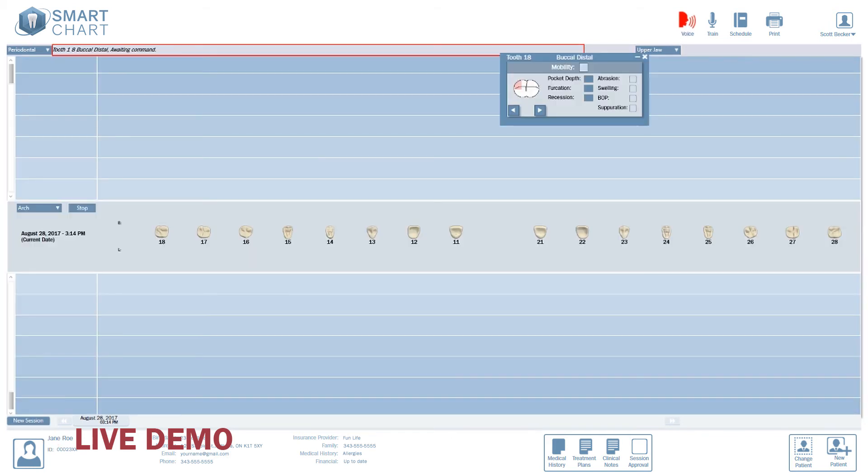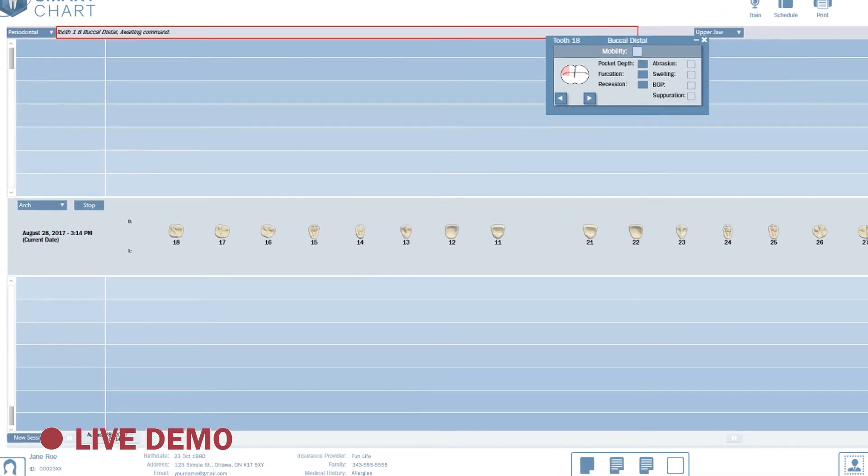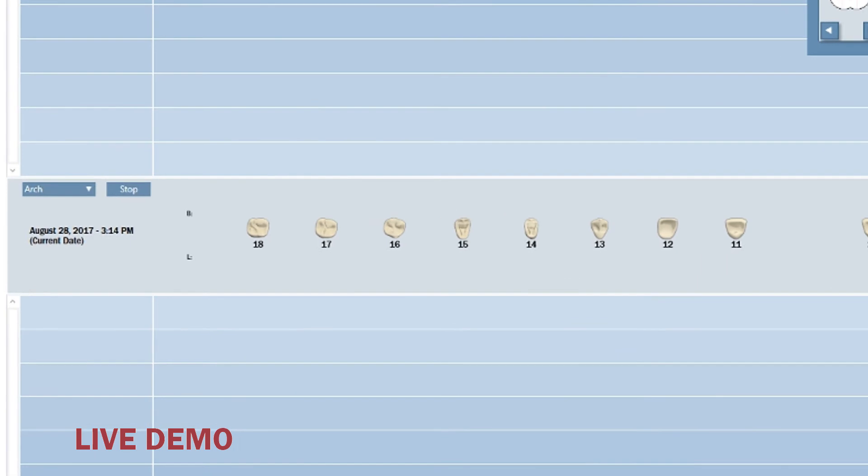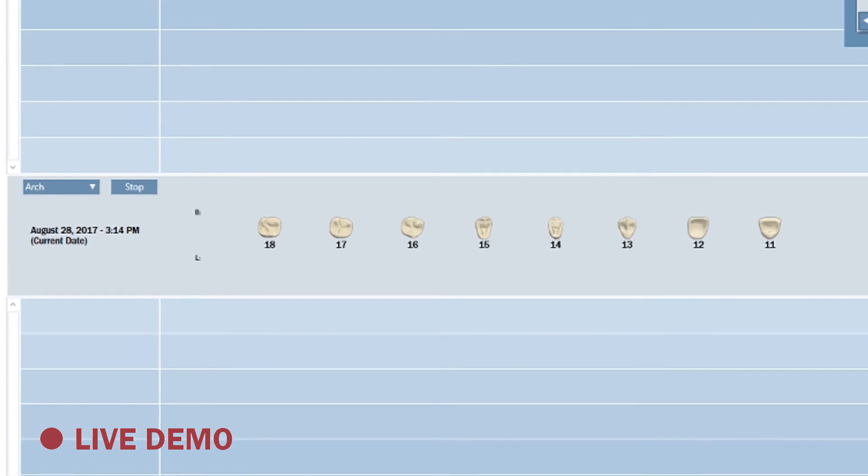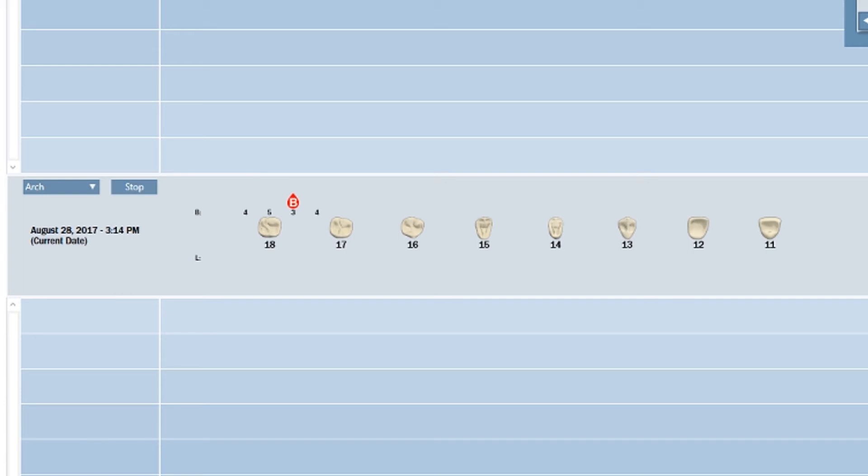In the perio chart, it's just as easy. Wrong pocket depth or condition indicator? No problem. 4. 5. 5. 5. Bleeding. 4. Oops. Previous. 3. Remove bleeding. Next. 3. Correction done.